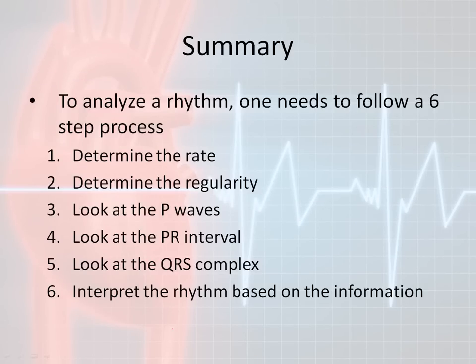I hope this presentation will actually help you understand how to interpret a cardiac rhythm. Just remember that whenever you analyze a rhythm, you need to follow the normal 6-step process like you would any other type of assessment to determine what is wrong with something. Just remember to determine the rate, the regularity. You want to look at the P waves, look at the PR interval, look at the QRS complex, and then as we go through this class, you will be able to start to interpret the rhythm based on just that information.